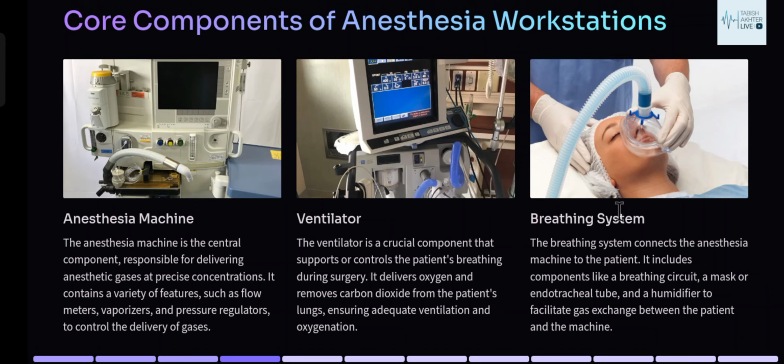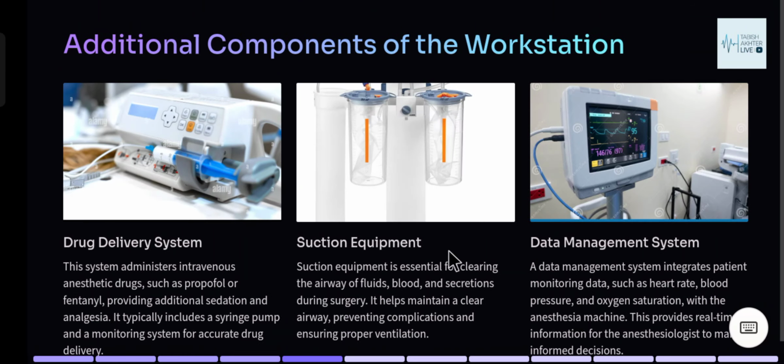Slide 4. Additional components of the workstation. Drug delivery system. Administers intravenous anesthetic drugs like propofol or fentanyl for added sedation and pain relief, typically through a syringe pump with a monitoring system.